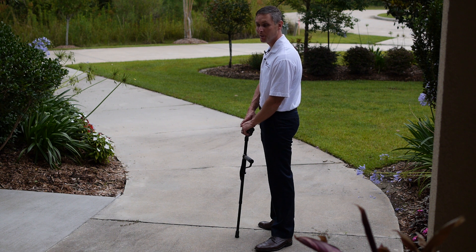Hi, I'm Dr. Matupelo and I want to take a moment to show you how to properly walk with a cane.